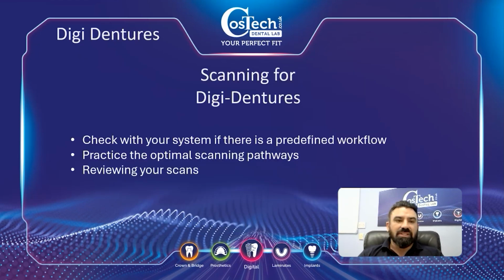So how do you scan for Digi-Dentures? A lot of people I know are already very big users on the Crown and Bridge side. Scanning for Digi-Dentures, there are a few nuances that you need to be aware of. The first thing is various different scanning systems have already predefined workflows. I know 3Shape, Itero, Medit, they all have options for scanning for a denture.